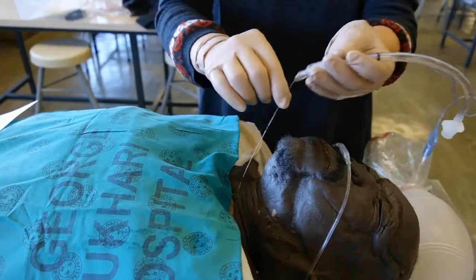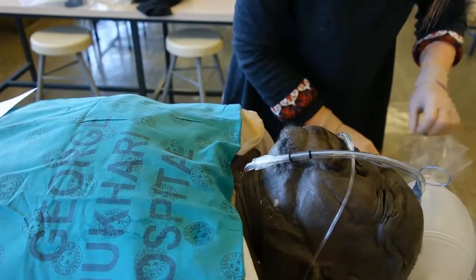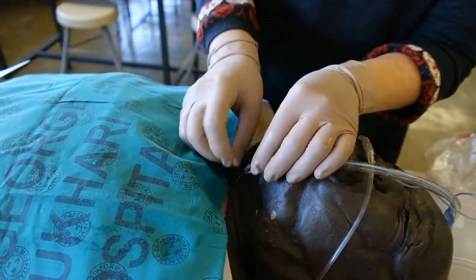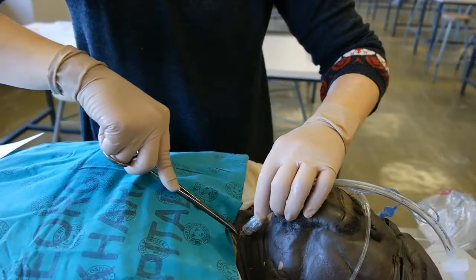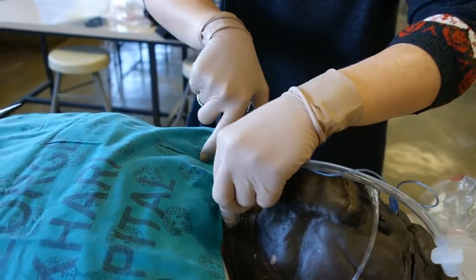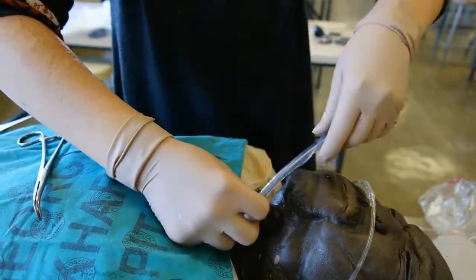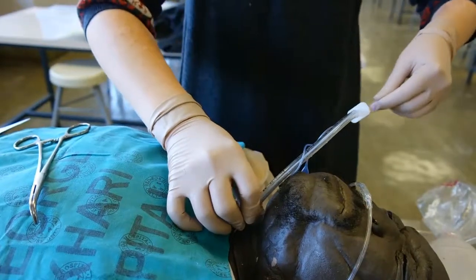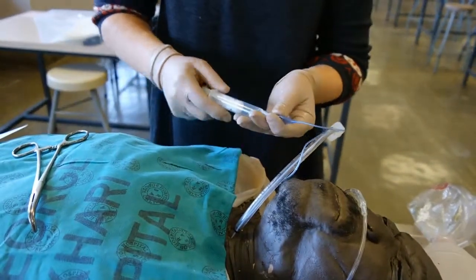Thread a size 5 or 6 endotracheal tube over the guide wire. Use a size 10 blade to make a horizontal stab incision over the guide wire into the trachea. Using your curved artery forceps, guide the endotracheal tube into the trachea. Once the balloon of the endotracheal tube has passed into the trachea, remove the guide wire and inflate the balloon.